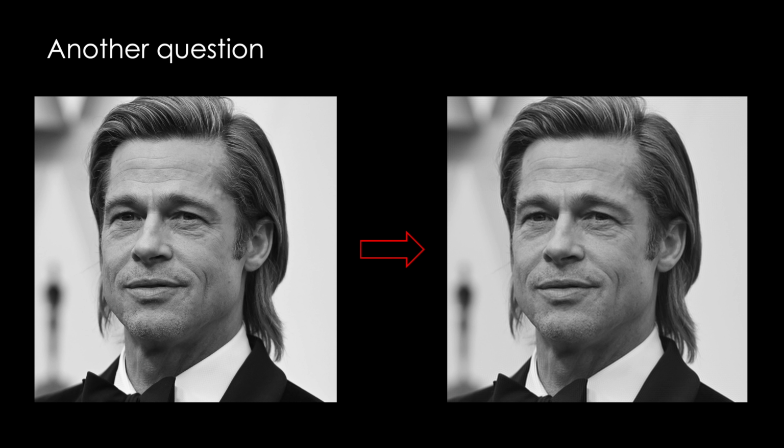It's subtle, but we've introduced just the right amount of blur into the picture that those harsh lines from being married to Angelina Jolie all those years have been smoothed over and are less apparent. How did we do this? Well, it might not be as apparent in this case since we're working with an image and not an audio recording like in the previous example, but we in fact did the same thing. We used a Fourier transform to see the frequencies making up this picture, deleted the ones leading to those harsh lines, and then converted it back into the picture. It is this process that you must understand in order to figure out how MRI machines create images.